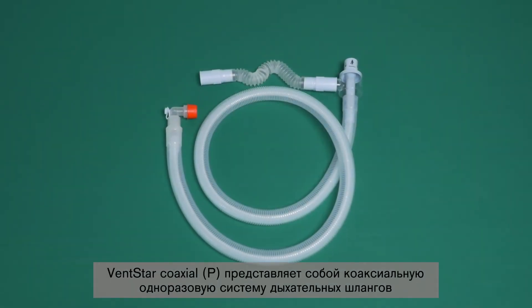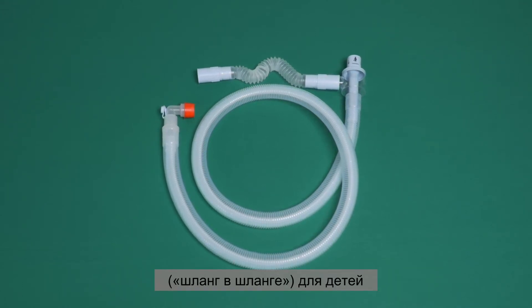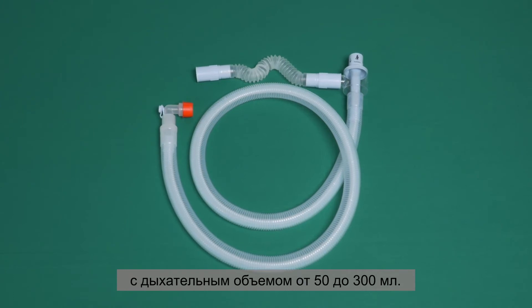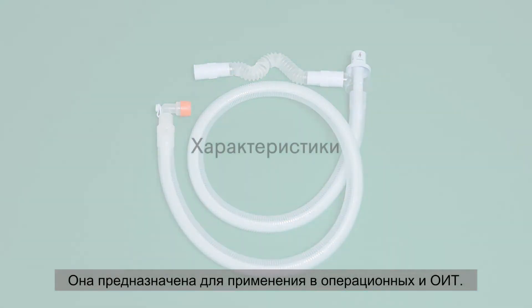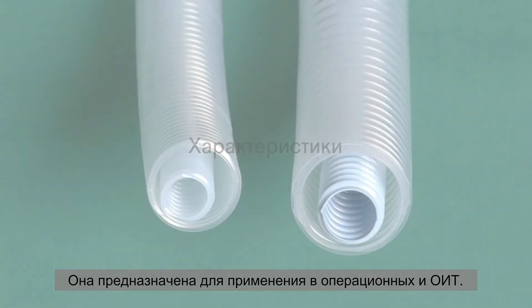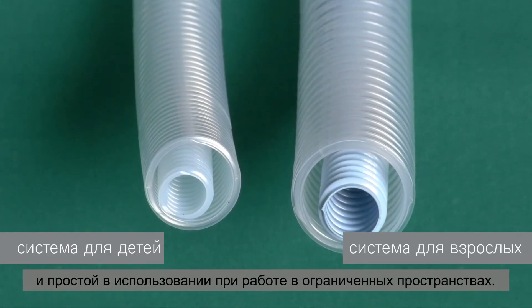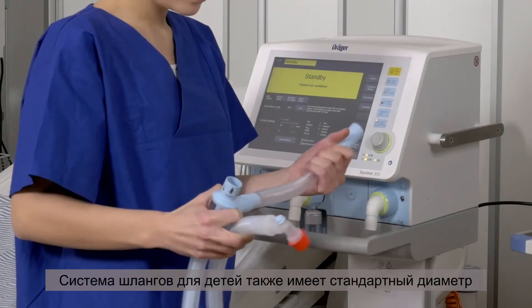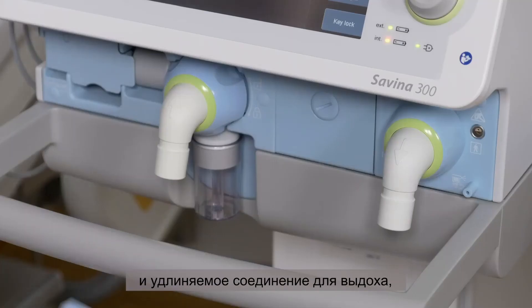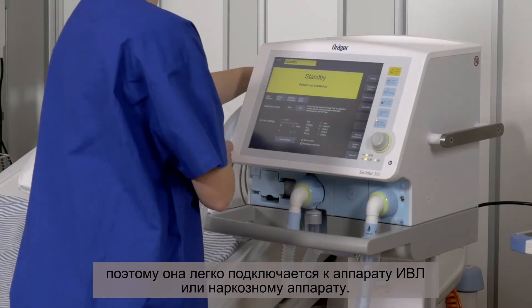The VentStar Coaxial P is a single-use breathing hose system with hose-in-hose design for pediatric patients with a tidal volume between 50 and 300 milliliters. Its scope of application includes the OR, but also intensive care. The small hose diameter makes the pediatric version more lightweight and easier to use when working in tight spaces. The hose system for pediatric patients also features a standard diameter and an extendable expiratory connection, and is therefore easily connected to a ventilator or anesthesia machine.